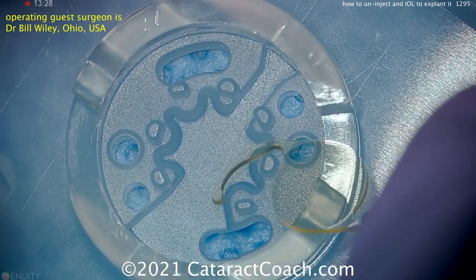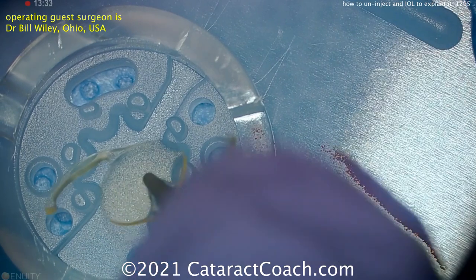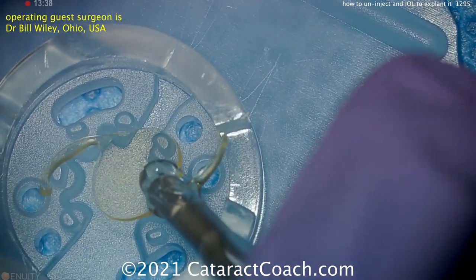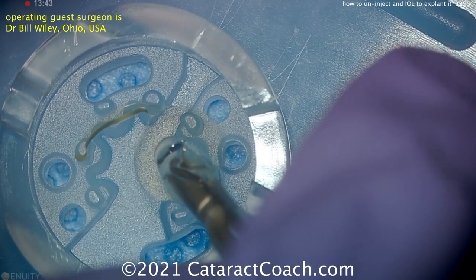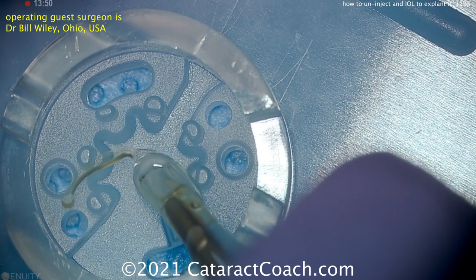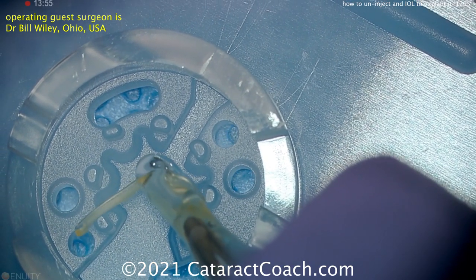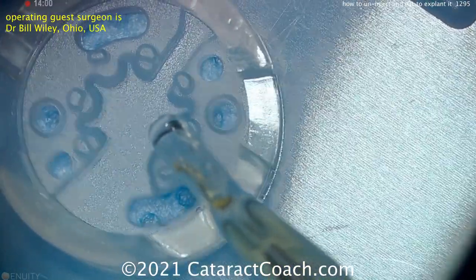Here is a trial in a lab — an IOL is being grabbed with forceps, a cartridge is positioned, and the IOL is simply un-injected by grabbing and pulling it out. You can see the lens folds up on itself as it goes back into the cartridge. This could damage or fracture the lens, but that doesn't matter since you're getting rid of the lens anyway.